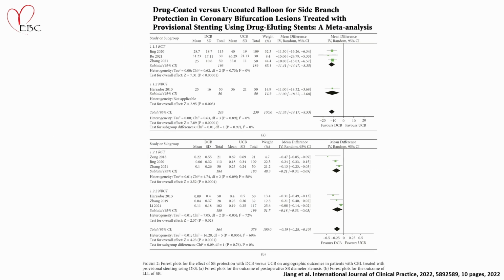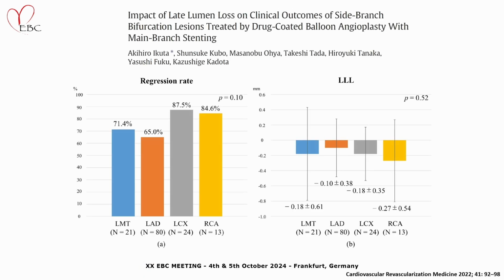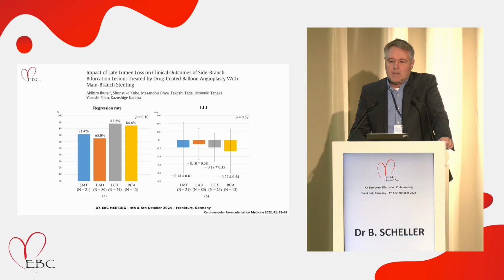There's also a meta-analysis looking from different trials, non-randomized trials included, on the impact of drug-coated balloons on the treatment of side branches, and also they report a benefit in clinical events. But to be honest, I'm not really convinced that we can see this big difference in clinical events when we are focusing on the side branch.